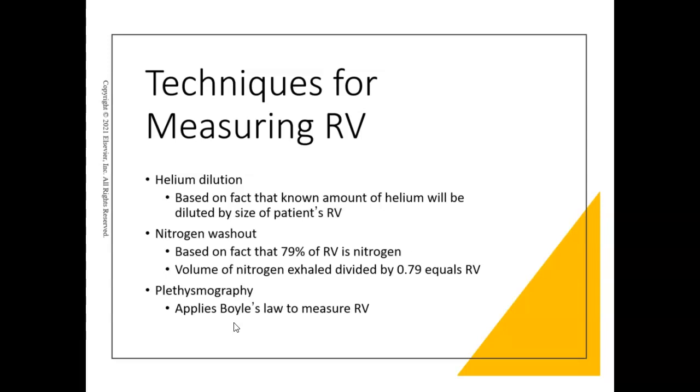I've had patients completely freak out and get claustrophobic or super anxious doing plethysmographies, and then I've had to go to a backup. So typically any PFT lab, even though this is the gold standard, one of these backups should be available. Most labs typically use nitrogen washout as their backup.